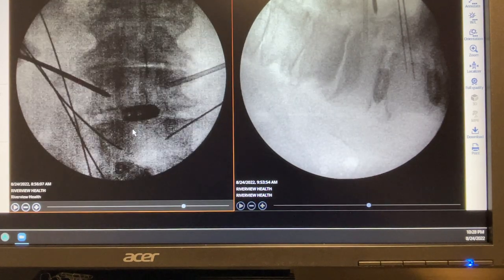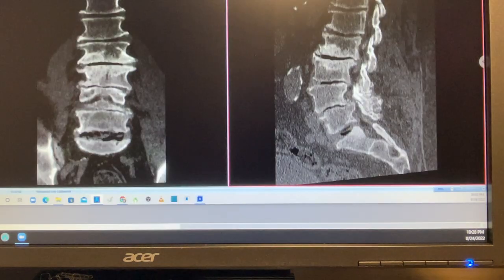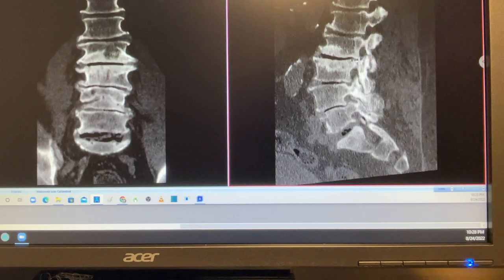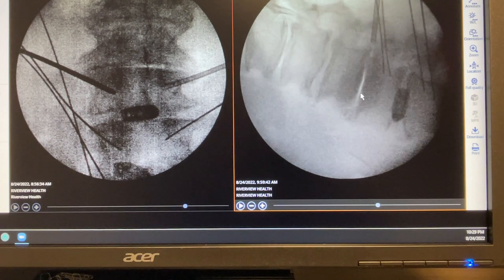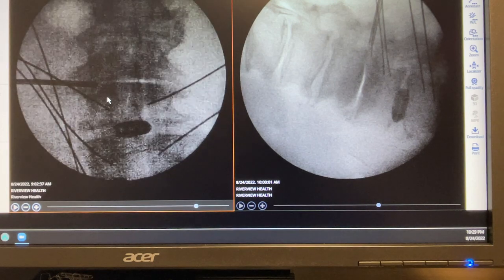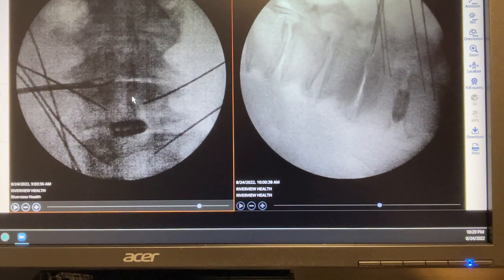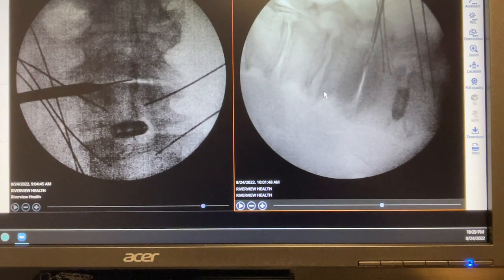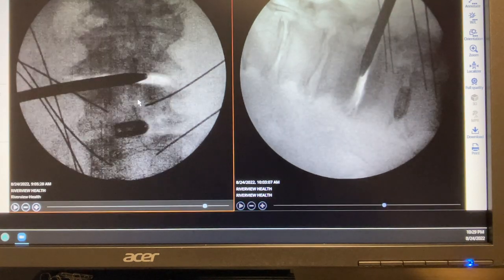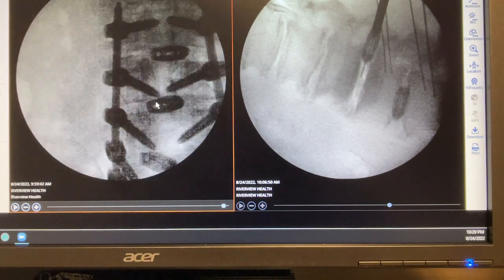We then enter the disc at L2-3 after placing the K-wire. This is the most sclerotic level — the previous CT shows how severe the situation is there. We have to follow the bends to secure the K-wire inside the disc space. A straight K-wire had difficulty going around the curve, so we bend it to pass the first curve, then bend it the other way to go around the curve to the other side. The K-wire then opens up the space, allowing us to perform the discectomy and place the cage. The remaining K-wires are then placed.